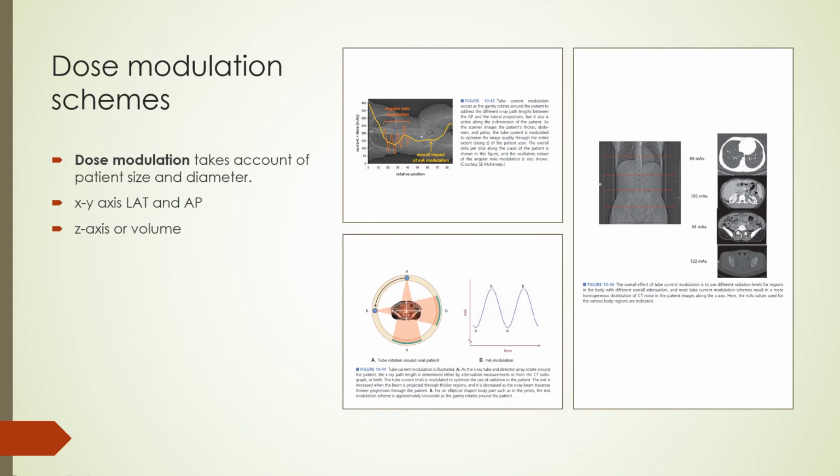The mA control is done within a specified mA window so that the dose the patient receives is controlled by the noise level selected for patient images within that mA window. The mA window set determines the maximum and minimum dose levels and the image quality achieved. Setting a high mA window and a low noise level means a possibly higher patient dose.